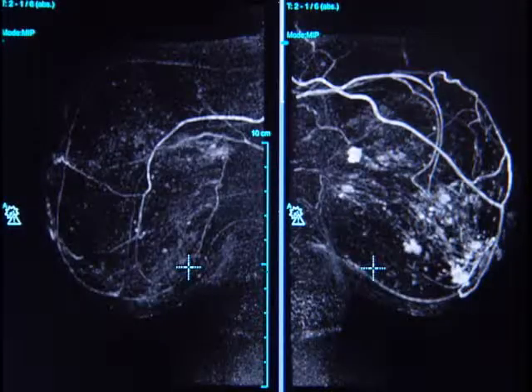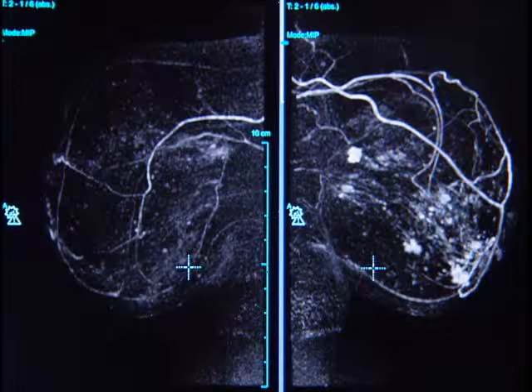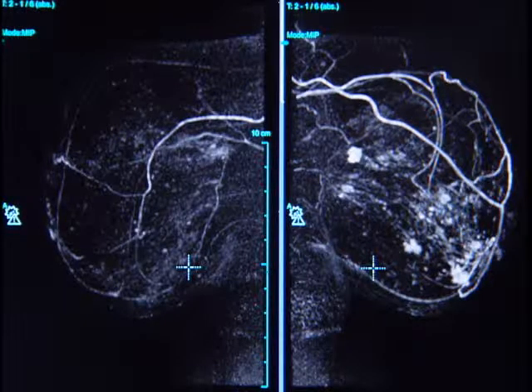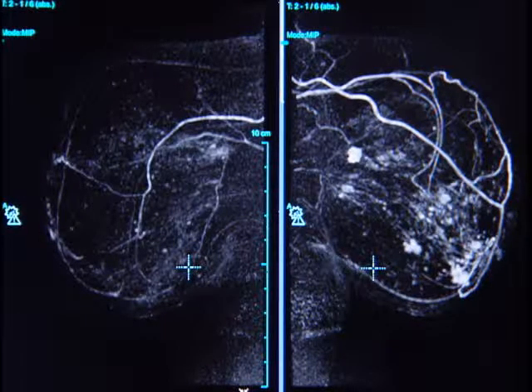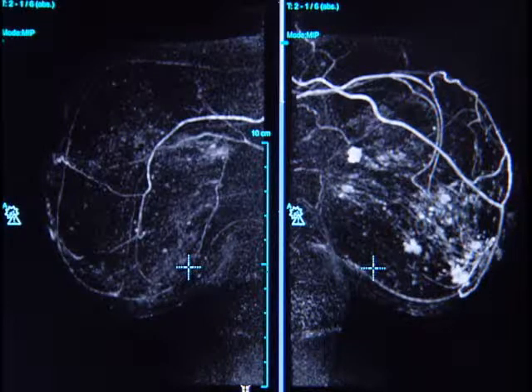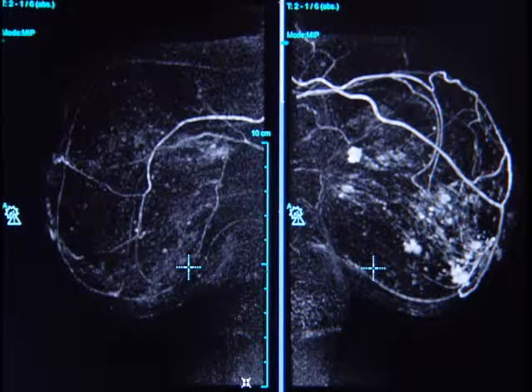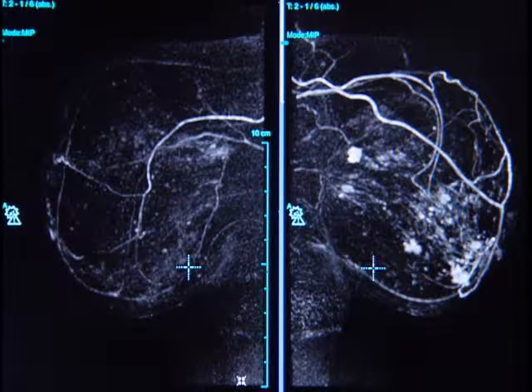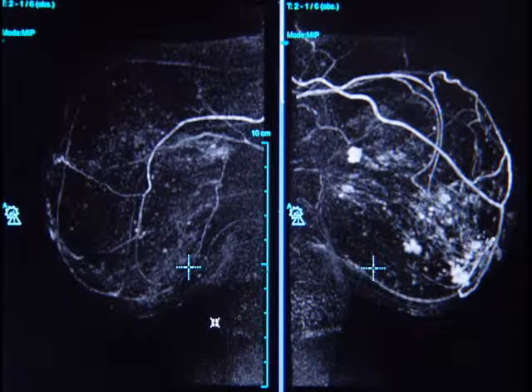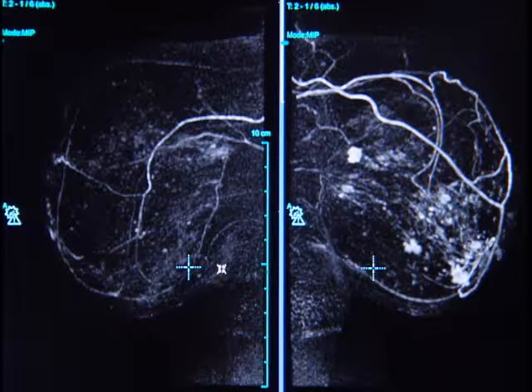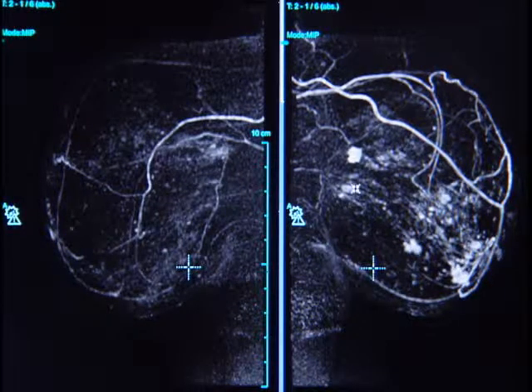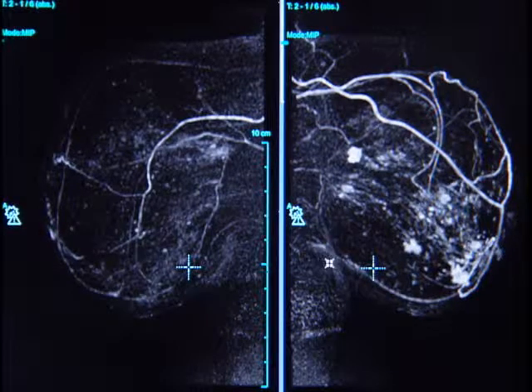This next hanging protocol is designed for sagittal parallel imaging. This is a more challenging hanging protocol to design. Our approach to imaging is to always, when possible, evaluate simultaneously the signal characteristics of the breast. As such, when we obtain our sagittal parallel images, we still like to compare right-to-left breast simultaneously.